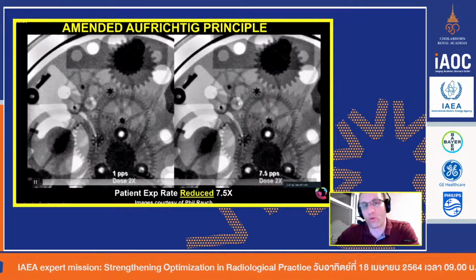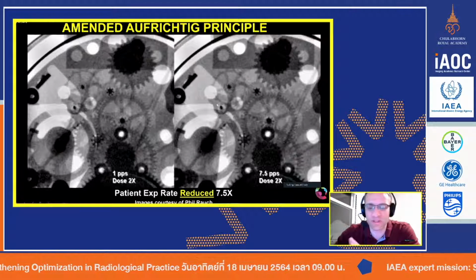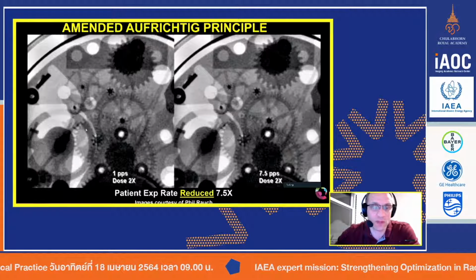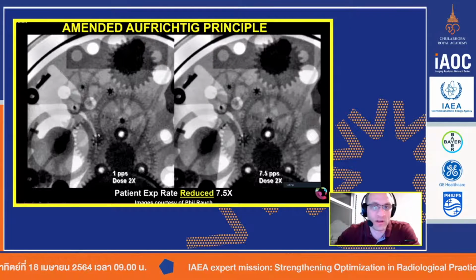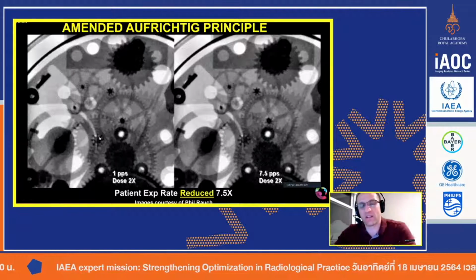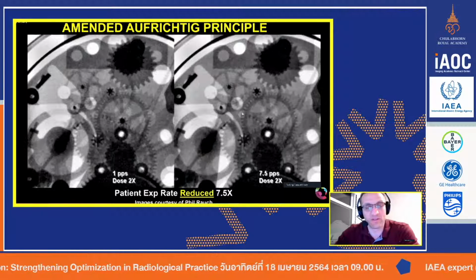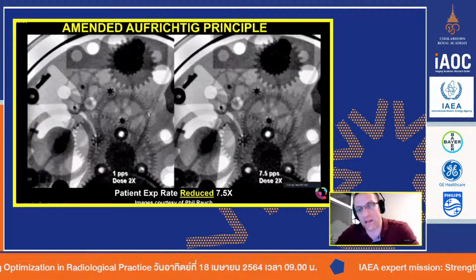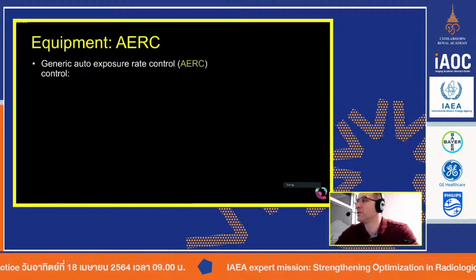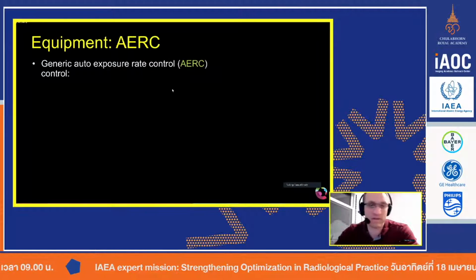And in a real world example, when our physicians are doing line placement, really simple stuff, they almost always use 1, at most 3 pulses per second. It's because it's meant to be a low dose, very simple procedure. They can advance the lines, they can do whatever they need to. The image quality is comparable enough so that they can see the line inside of the anatomy and they can go forward. So let me turn that off and get back over here.